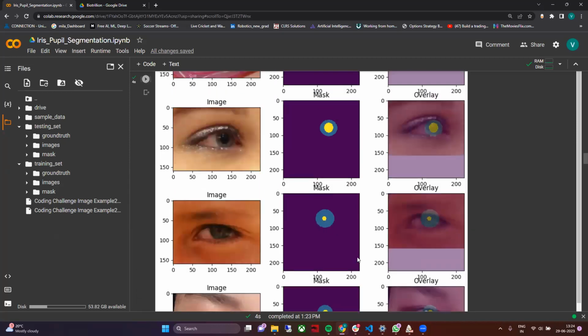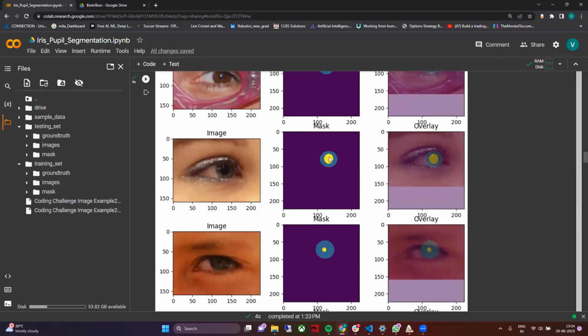I think I also didn't mention one more thing. So if you see here, iris is coded differently, pupil is coded differently. Did I swap that? Sorry. The yellow one is pupil and the green one is iris. Yeah. So how do you think that difference came up?